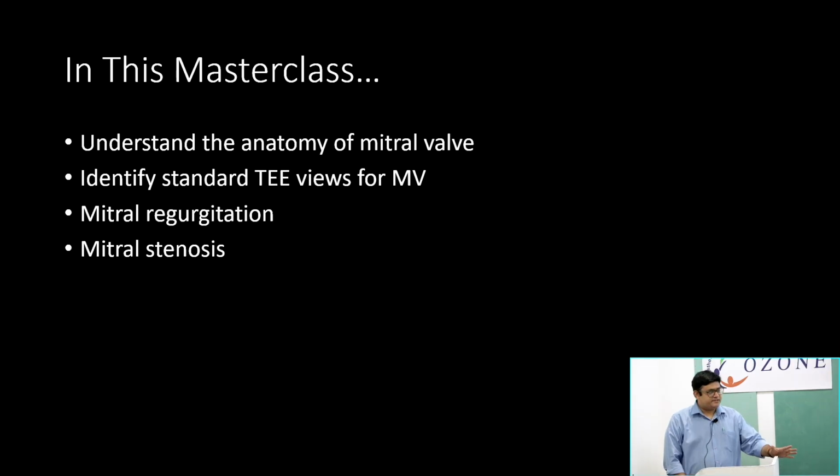So the topic for today is TE of mitral valve. In this masterclass, we are going to understand the anatomy of the mitral valve and identify the standard views for the mitral valve, learn about mitral regurgitation and mitral stenosis. The first few slides are just the revision of the previous lecture.